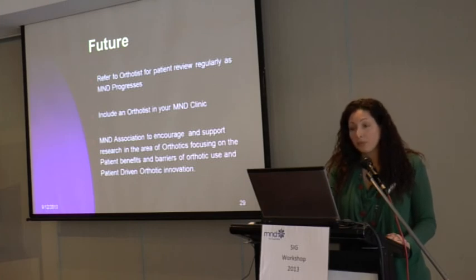So, please refer to an orthotist for patient review regularly, especially as the motor neuron disease progresses. Please include an orthotist in your motor neuron disease clinic, and hopefully the Motor Neuron Disease Association will encourage and support research in the area of orthotics, focusing on patient benefits and barriers of orthotic use and patient-driven orthotic innovation.